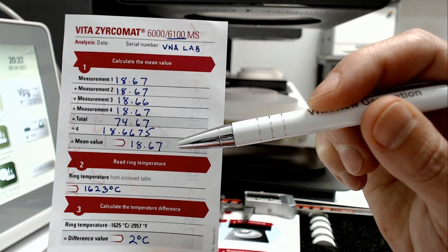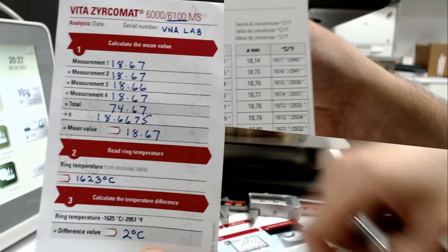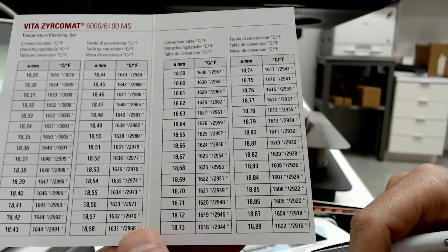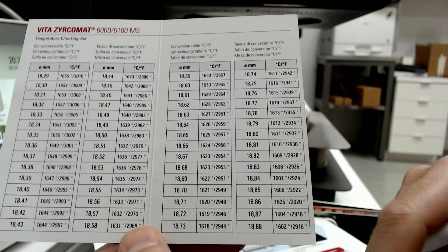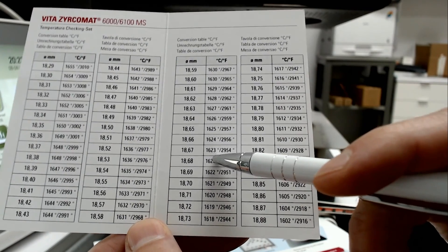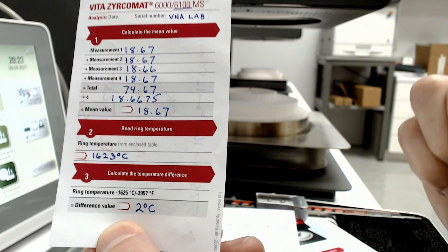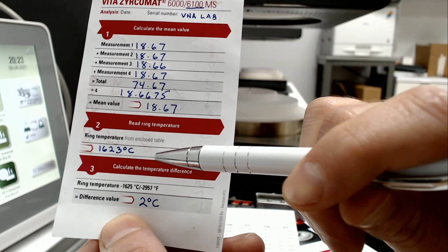Once we have our mean value, we're going to use it to reference our temperature chart. Here is our temperature chart. Our average value in this example was 18.67. So 18.67 gives us a temperature of 1623 degrees. Back to our log sheet — the temperature from the table was 1623.